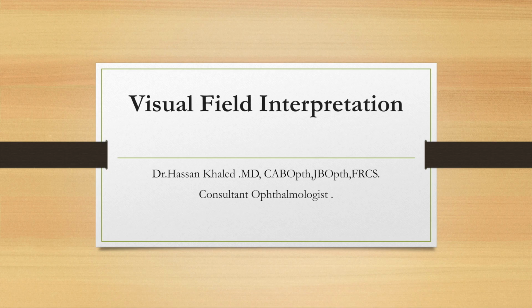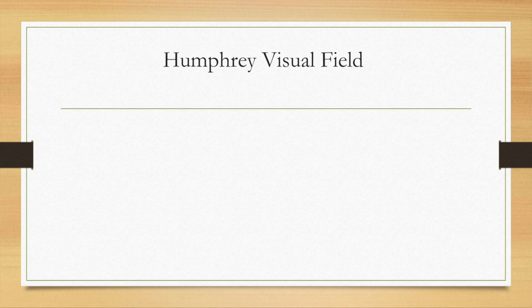I am going to talk about visual field interpretation in this presentation. My talk will be mainly about the Humphrey automated visual field, and my presentation will contain 5 sessions. Today I will start with the first session.